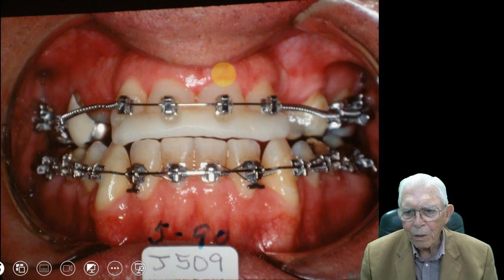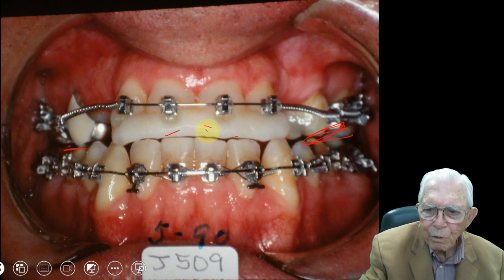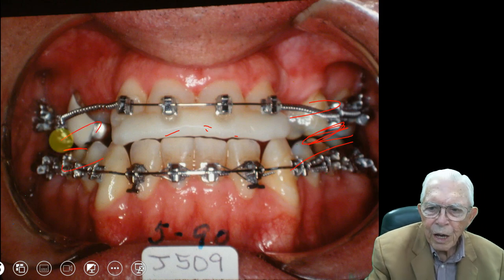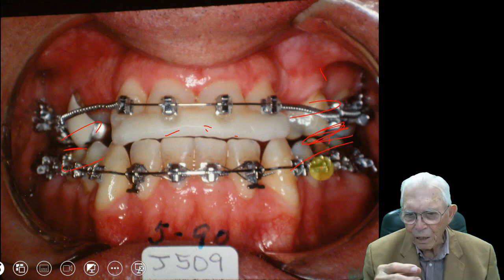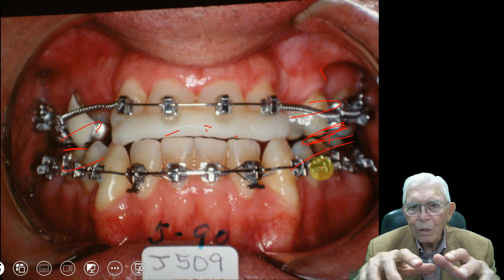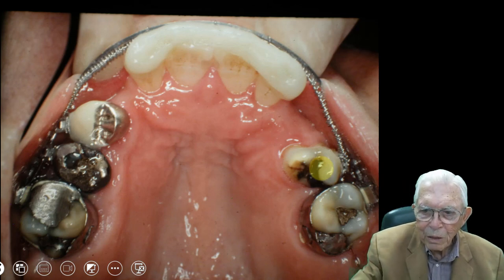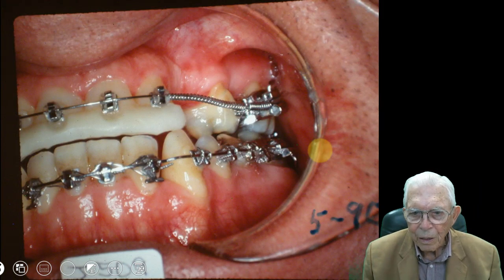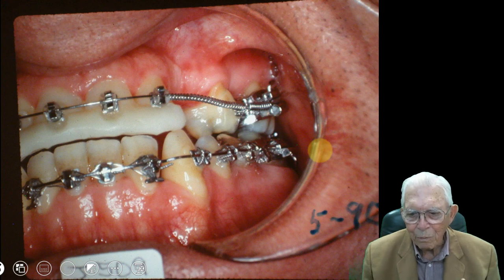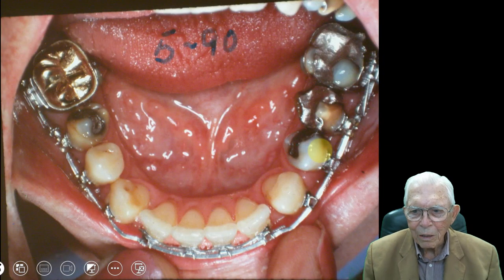Here we've got this bonded acrylic device in the front of his mouth and now he can chew on these teeth. When I first put this on there was a gap here — almost a half inch. This has come together and gives him some vertical height of his face that he didn't have when we started. We're going to get these upper teeth out over the lower teeth. He's biting into this acrylic and we've opened up space in here, so we'll have to have some bridge work done in that area.